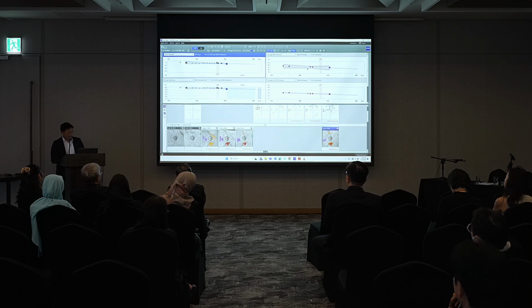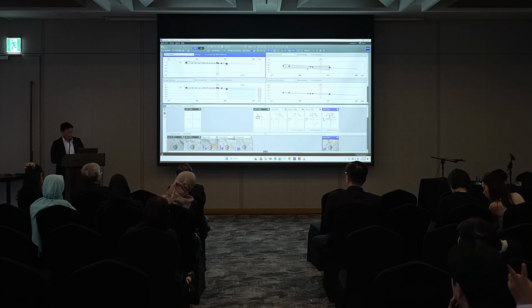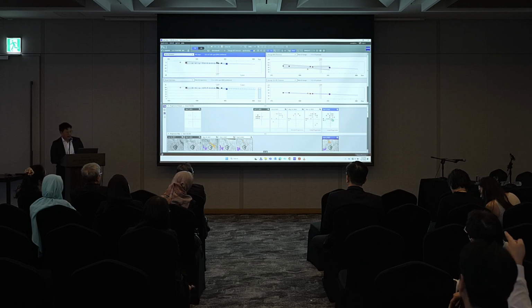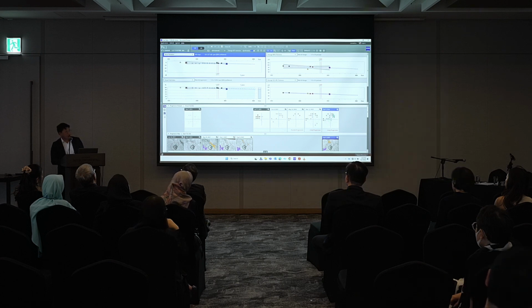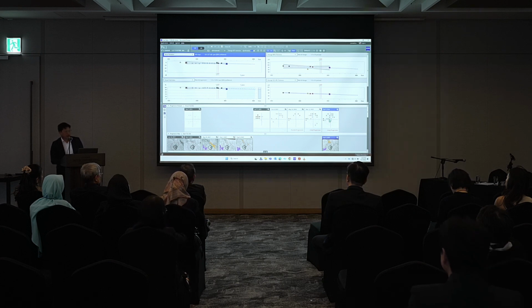Down the bottom, here's our event analysis where on the progression map, these are the triangles. And basically, black triangles are bad, is what I tell patients, right? So here's that visual field superimposed over time. And quickly, you can show your patient, hey, these are areas where consistently your vision is dropping and your visual field is deteriorating. Don't believe me?